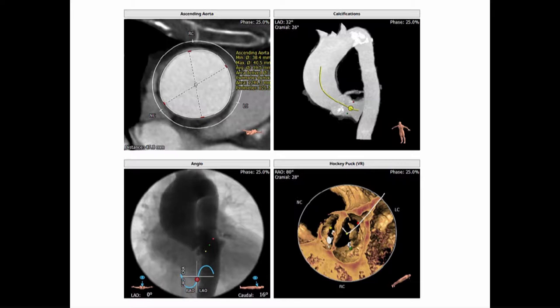When you get these CT scans, patients generally have their arms above their head. And when we position them on the table, their arms are not above their head, so there's some variability in terms of the exact view from the CT scan. So you have to check and adjust it sometimes.